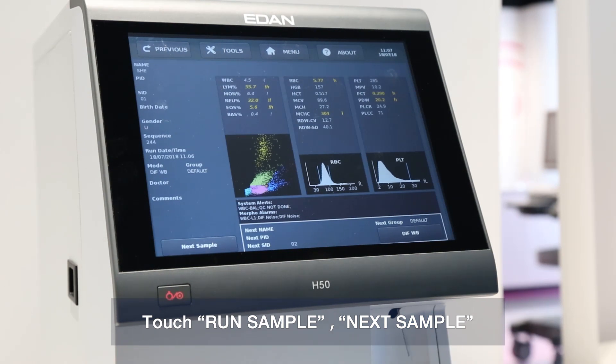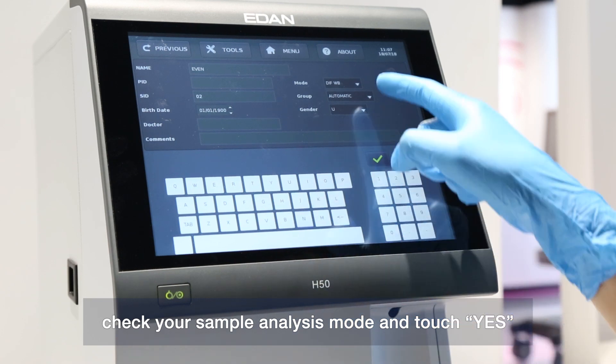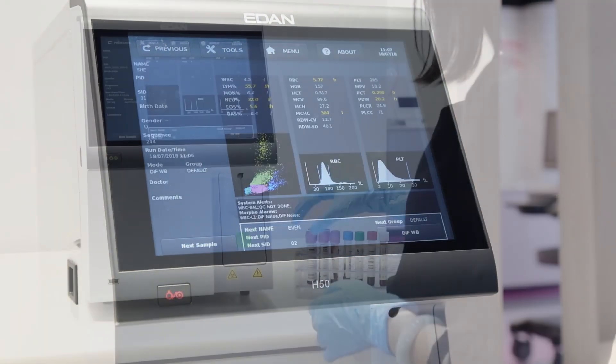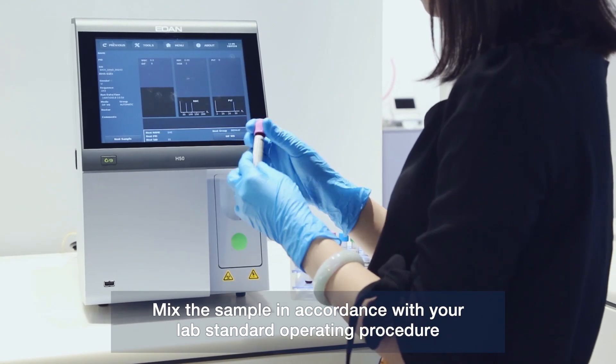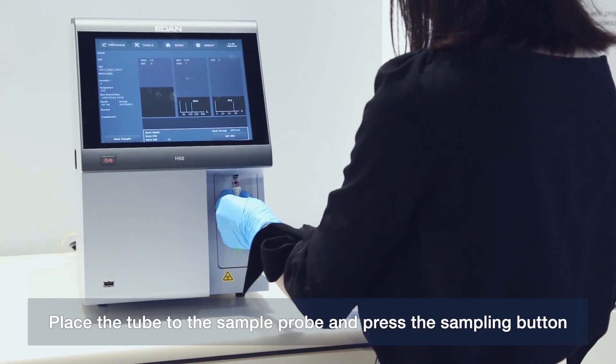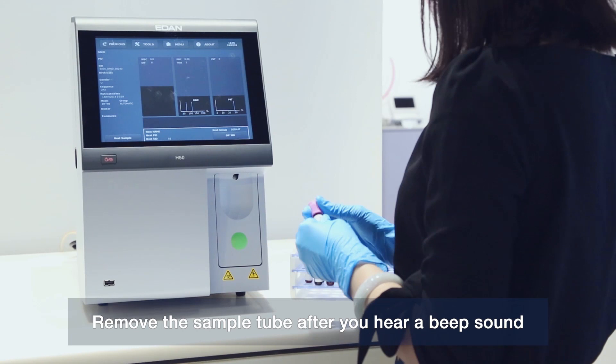Touch Run Sample, then Next Sample. You may enter the patient information, check your sample analysis mode, and touch Yes. Mix the sample in accordance with your standard operating procedure. Place the tube on the sample probe and press the sampling button. Remove the sample tube after you hear a beep sound.